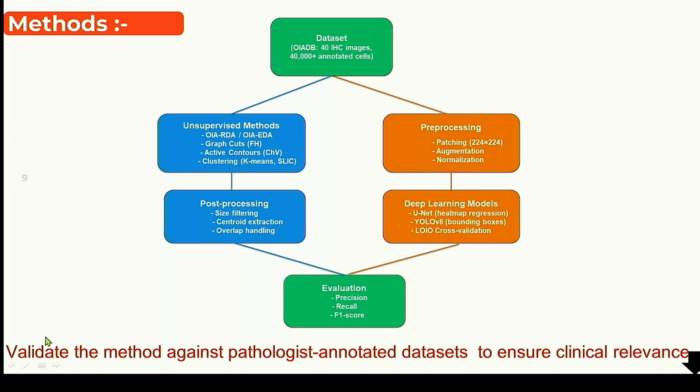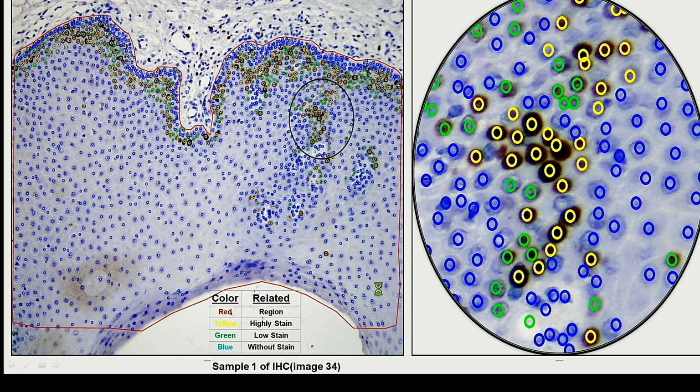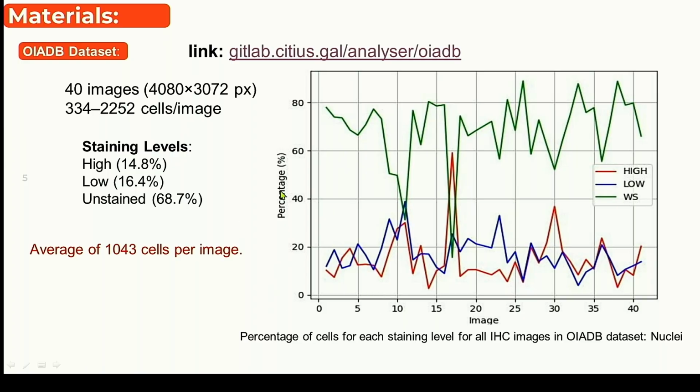All of these techniques were validated against the pathology annotated data set. Our data set before, we're showing here, all of these cells annotated by experts.